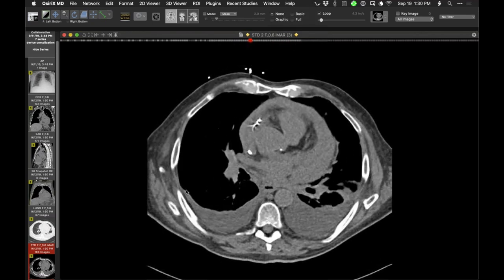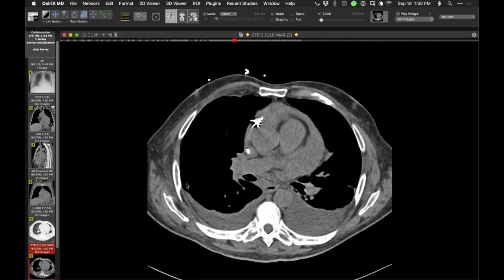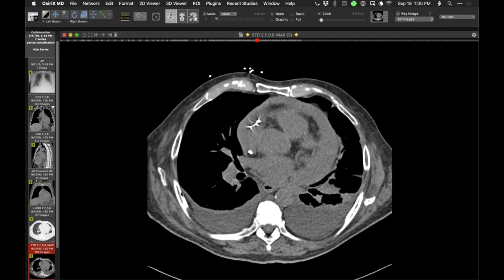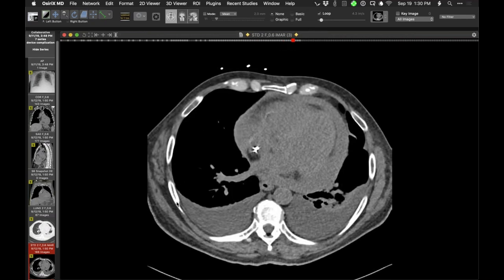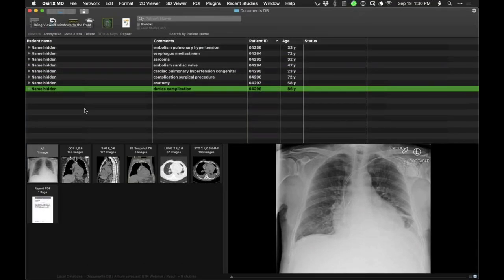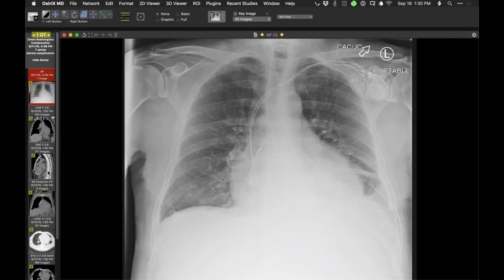I think it's the first atrial lead perforation that I have seen, whereas we've all seen a fair number of right ventricular leads perforate on occasion. Yeah, and unless it's projecting lateral, outside the heart, then it's hard to tell. I would just ignore that position of that left or right atrial lead every time.